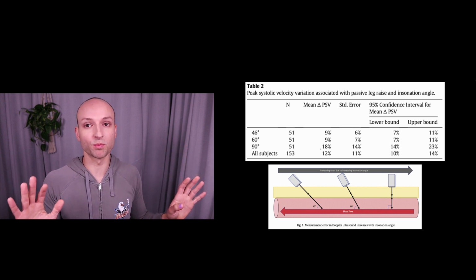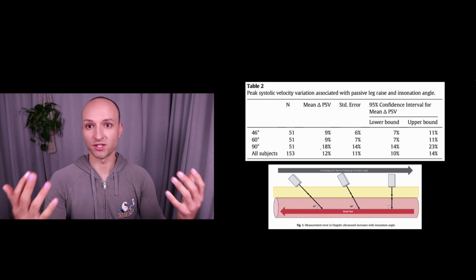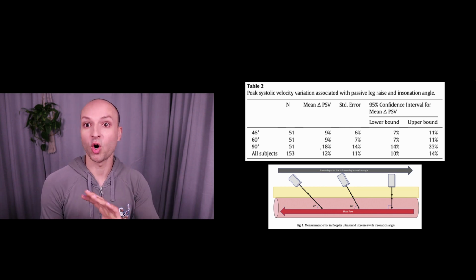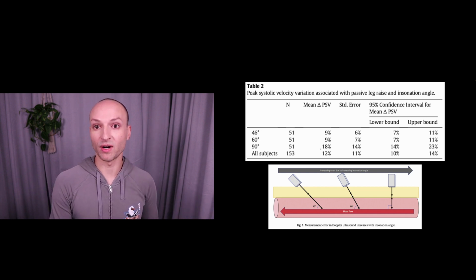You have much more deviation in what you'll get just based off the angle. Now, I'm sure somebody that's super smart will be able to say exactly why that happens. I don't know. I'm just going to assume it's like magic and that's just how it works. So all that to say, less than 60 on your Doppler angle is very important for everything but corrected flow time.